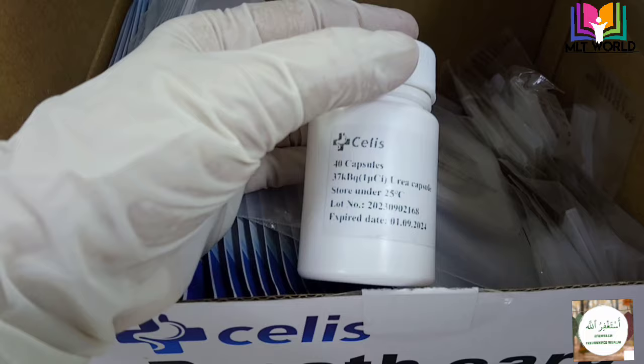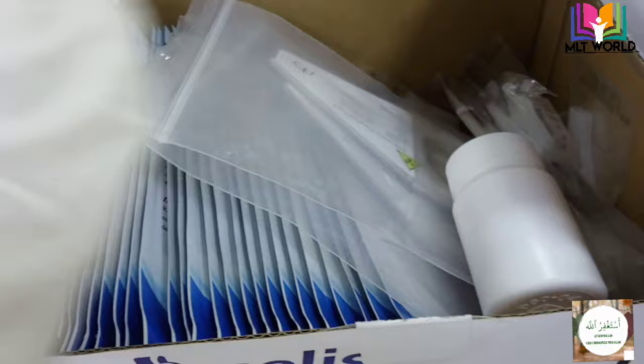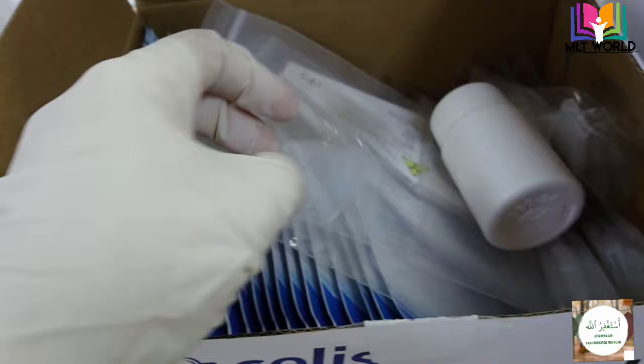What is the purpose of this capsule? When the patient takes this 14C labelled capsule, the urease enzyme in the stomach will break down the urea into ammonia and 14C. In simple terms, we can consider 14C as representing H. pylori.